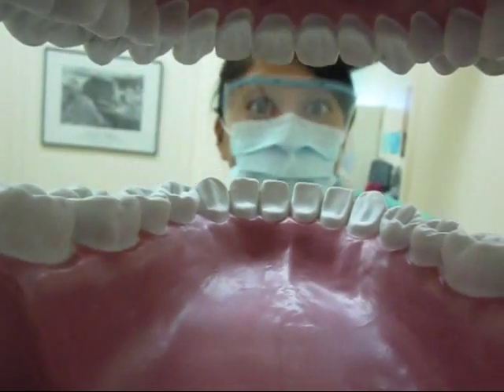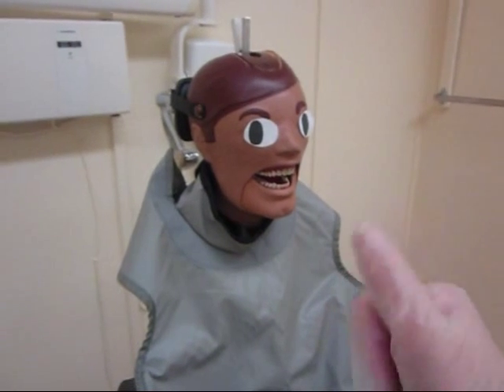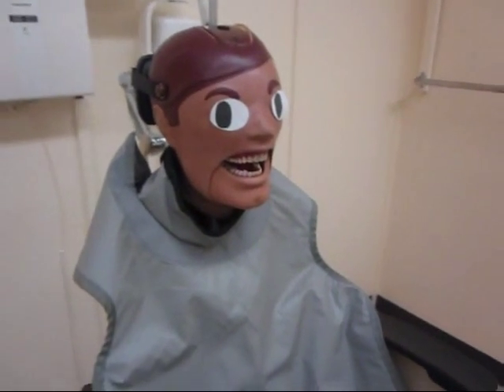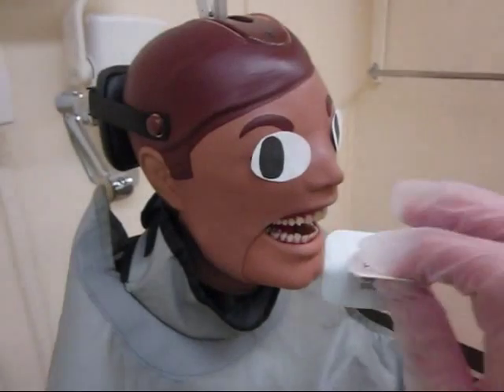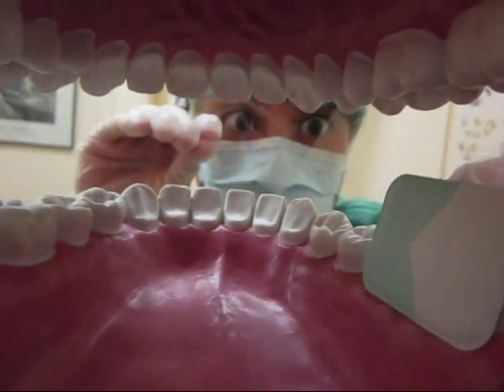How are you today? I'm doing great. How are you today? I'm doing great. Let's go ahead and get started, okay? We're going to take some x-rays. Now, go ahead and open wide for me. Say ah. Okay, close. Good.